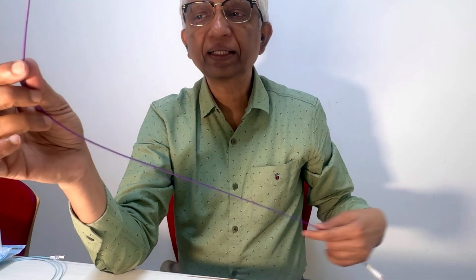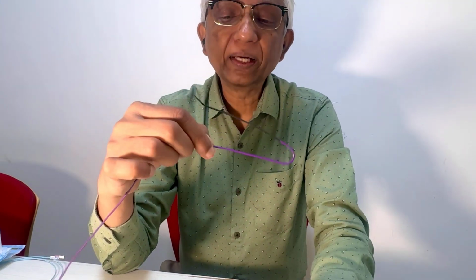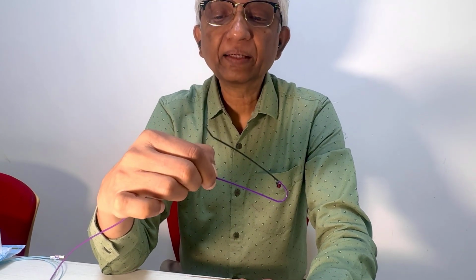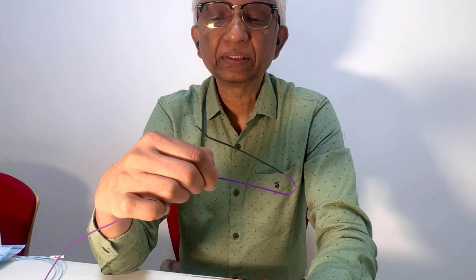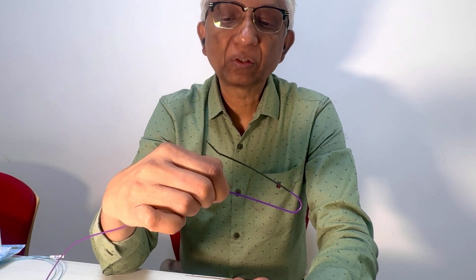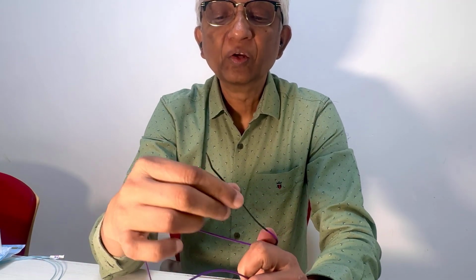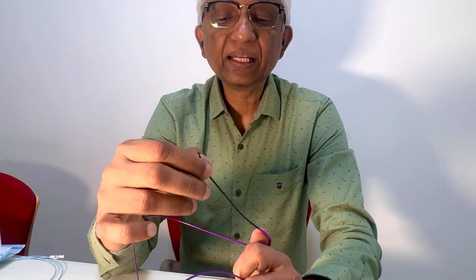So most of the uterine artery catheters are like this. They also at one time had created Simmons catheters for cerebral use like this. Never ever use it. In the internal iliac, breaking a catheter will not cause much harm. In the brain, you'll have a stroke. It's a disaster. Never ever use a soft tip catheter with a breakable tip for any cerebral work.